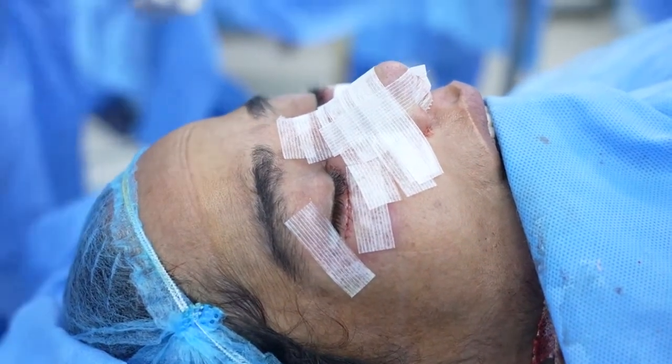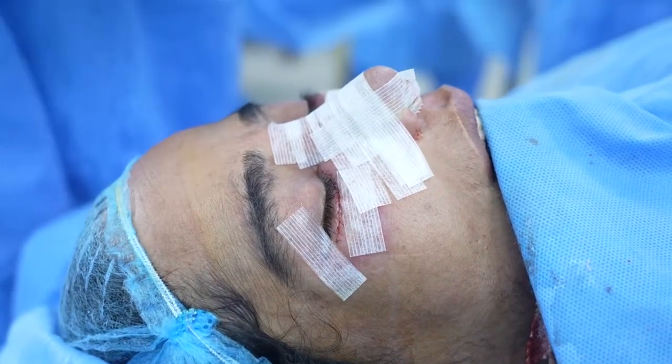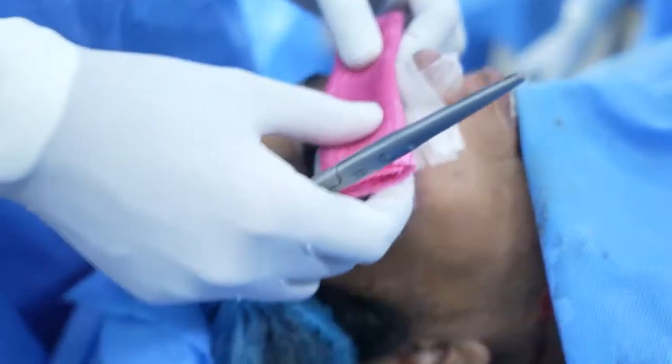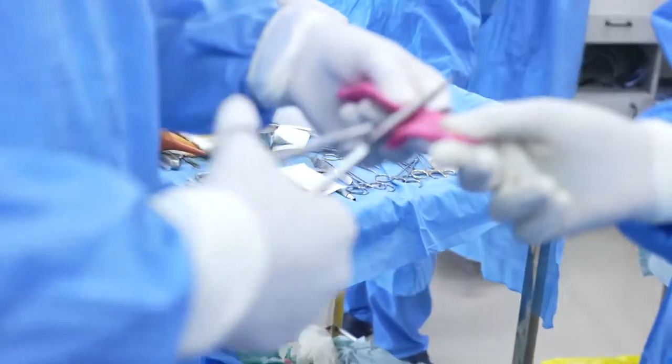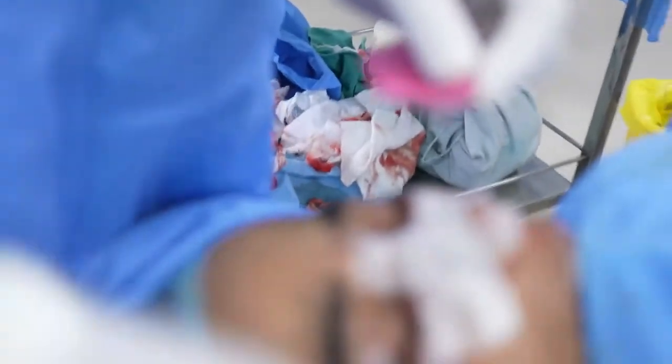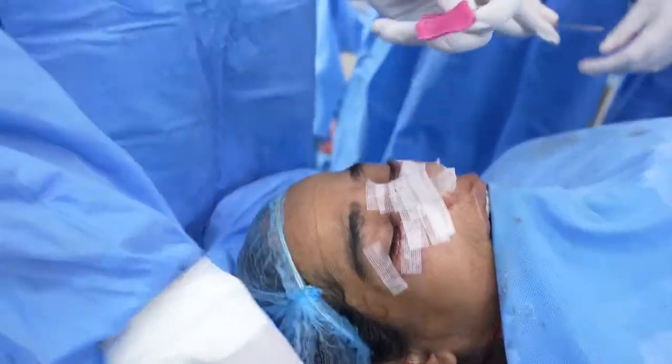Then we're going to show the splint now. So we've got the splint here ready. We're going to cut this down to get the shape. So we can measure it actually. So this is the extent that we need.